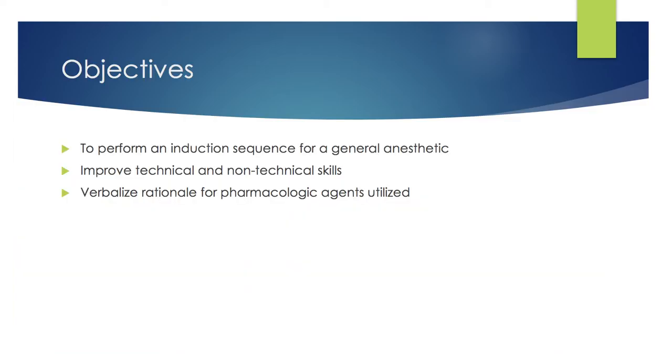The objectives of this presentation and simulation training are for all participants to perform an induction sequence for a general anesthetic, improve technical and non-technical skills, and verbalize the rationale for the pharmacologic agents utilized.